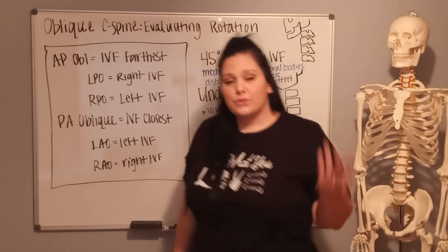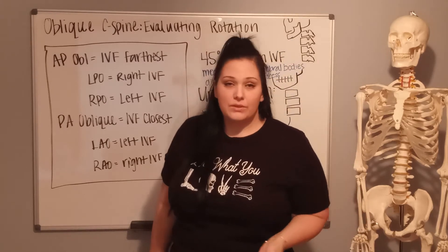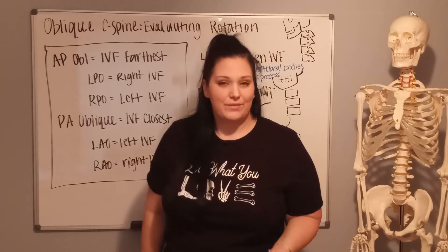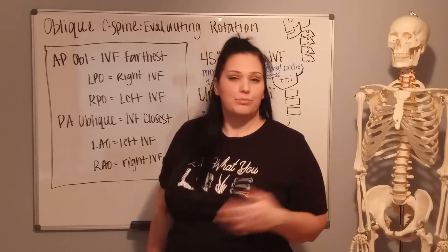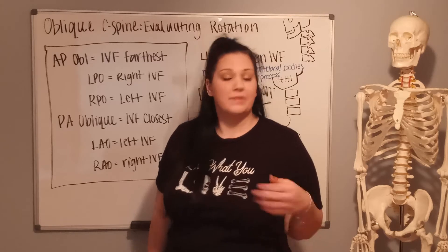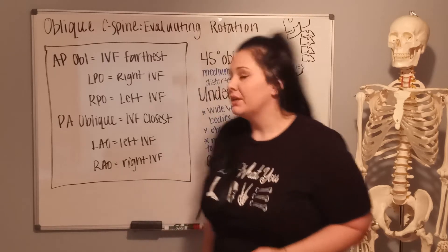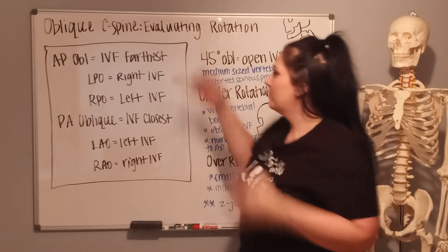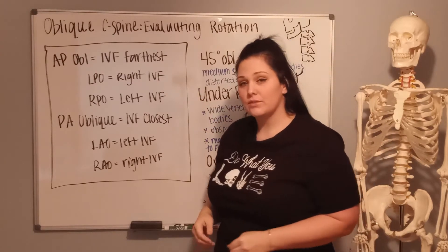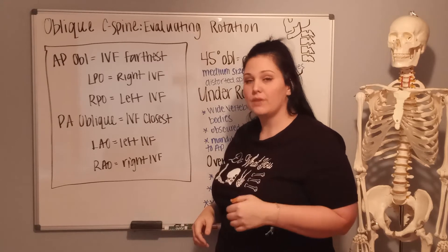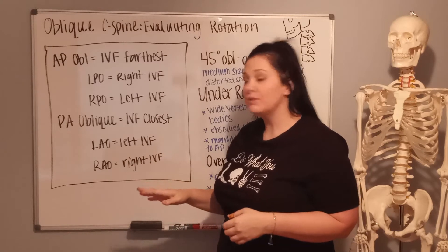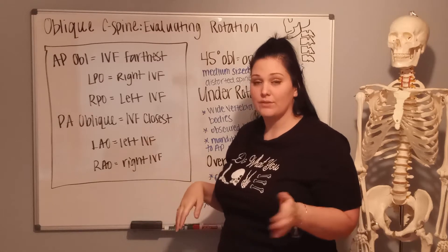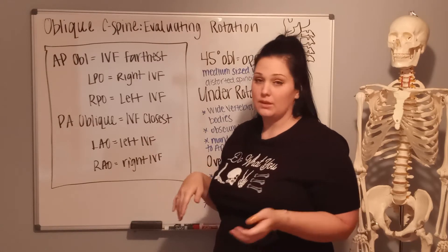With your oblique C-spine, the anatomy of interest is always going to be your intervertebral foramina, or IVF. In your AP oblique projections of the C-spine, you see the IVF farthest from the image receptor. And in your PA oblique projections, you see the IVF closest to the image receptor.